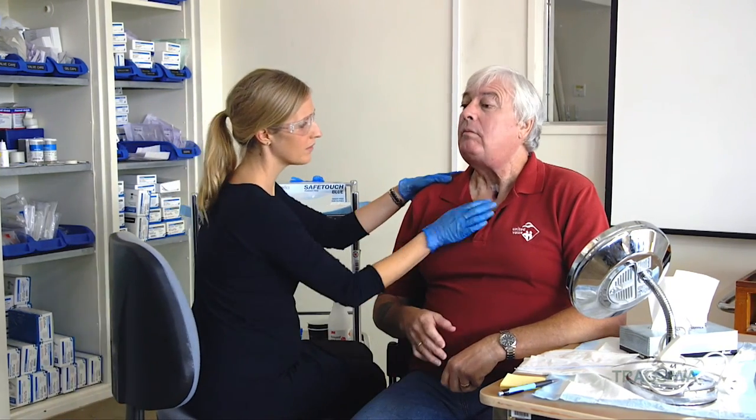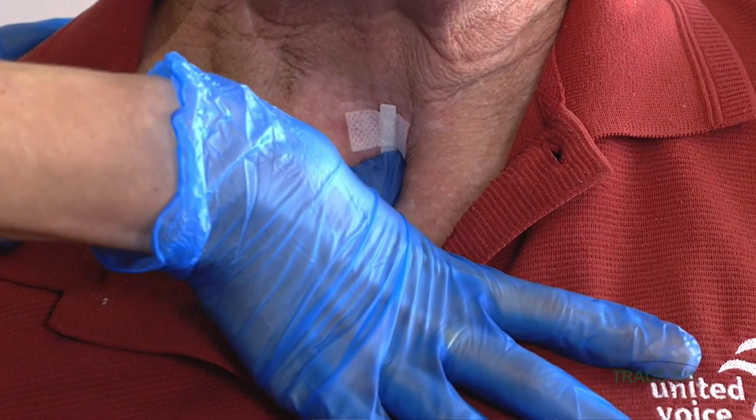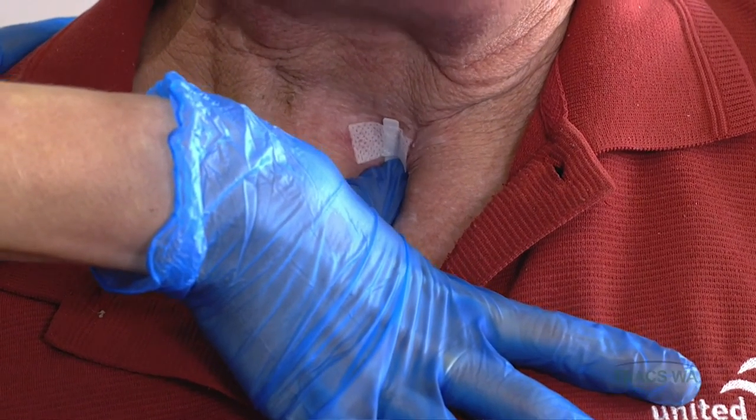What we're going to try this time, so I can be sure, I'm going to occlude your stoma with my thumb. I'm just going to ask you to count from 1 to 5 to see if we can get some better voice. Are you okay with me doing that? So take a breath in. And 1 to 5. 1, 2, 3, 4, 5.